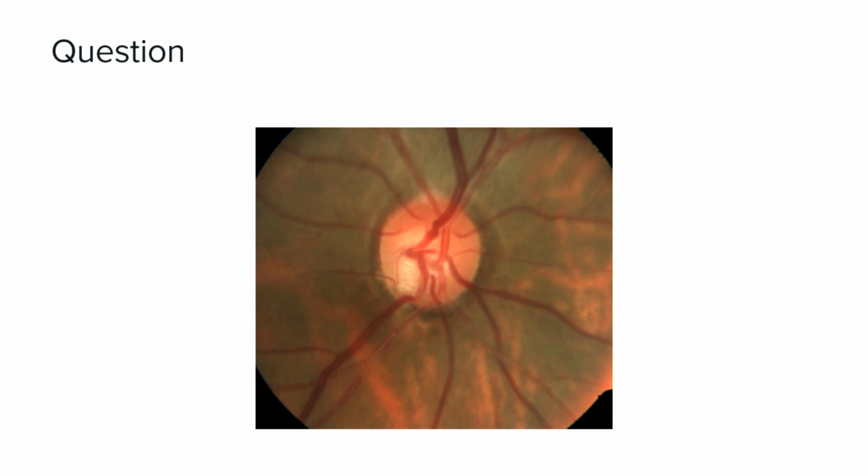Ma'am, the size of the optic disc looks like an average sized optic disc. It's a color disc photograph of the right eye. Right eye, yes. Size looks average, but pale it looks. No, it looks pink only. Pink. Then, next.